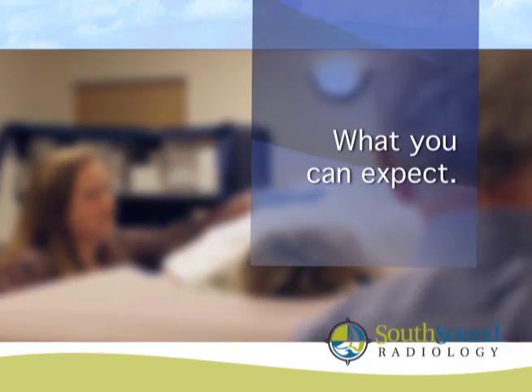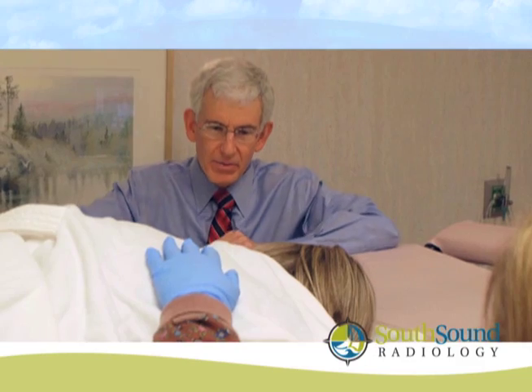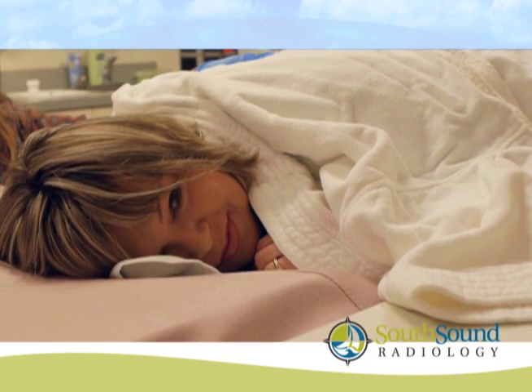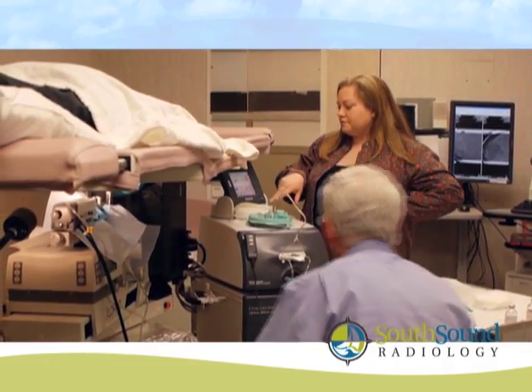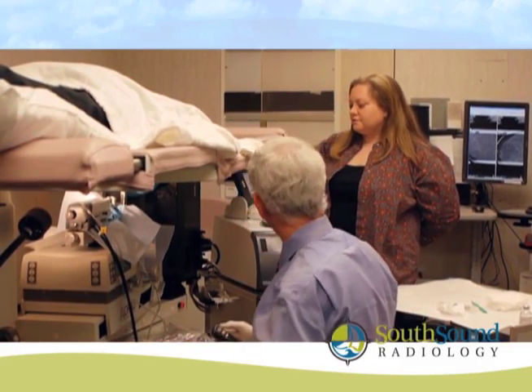A technologist and radiologist will work together to perform your biopsy. You will lie on your stomach on a special biopsy table with your breast positioned through an opening in the table. It is very important that you lie still to ensure accuracy of the procedure. Your breast will be carefully compressed to help keep it immobilized during the procedure.